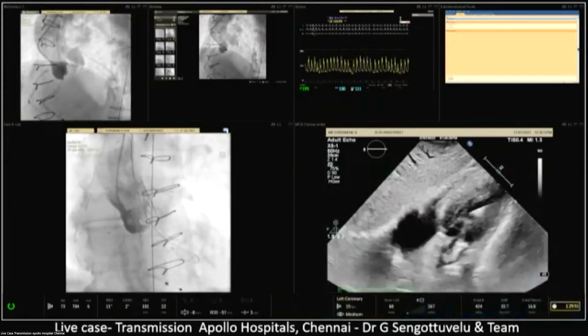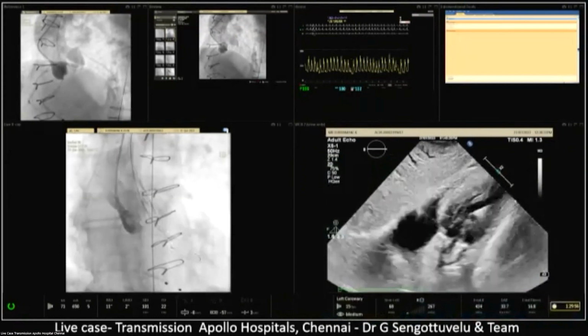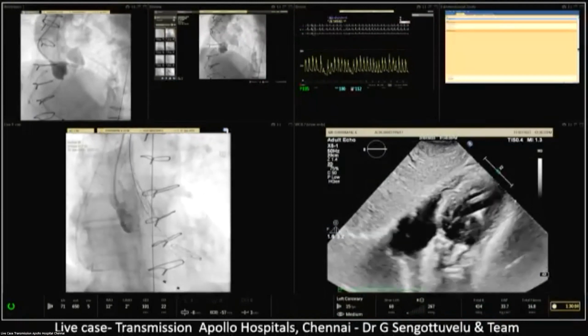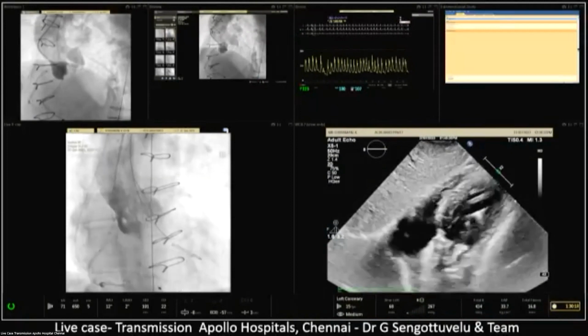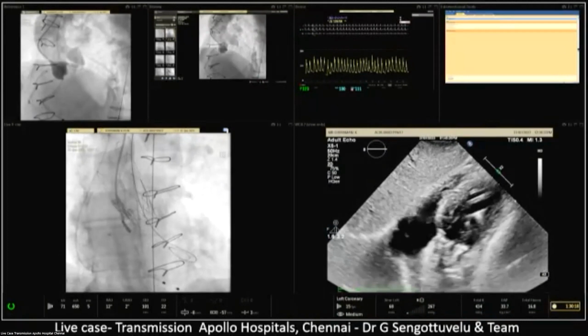I think this will stay. Hi. The upper crown is sitting nicely well below the left coronary. Hi, here's Dr. Ferenc from University Health Center Freiburg Bad Krozingen from Germany. So this patient is quite young. If I understood you right, he is 65 years. So we should have now really optimal result after TAVR procedure.